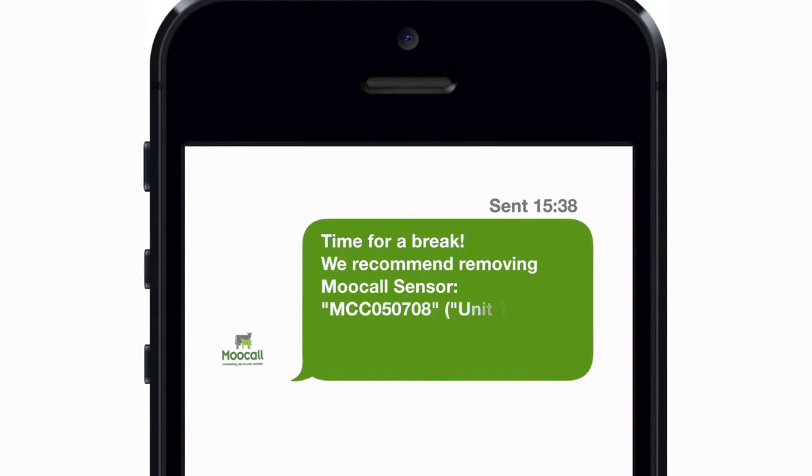If the cow has not calved after four days of wearing the sensor, an SMS will be sent to remind you to remove the sensor for four to five hours to give her tail a rest.